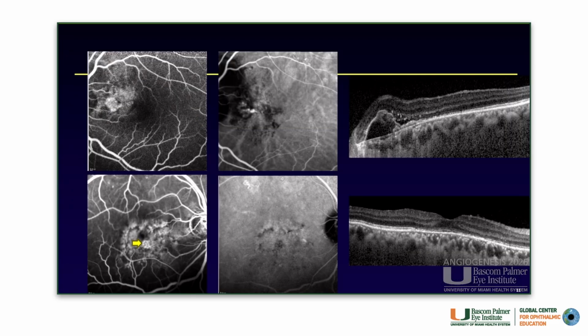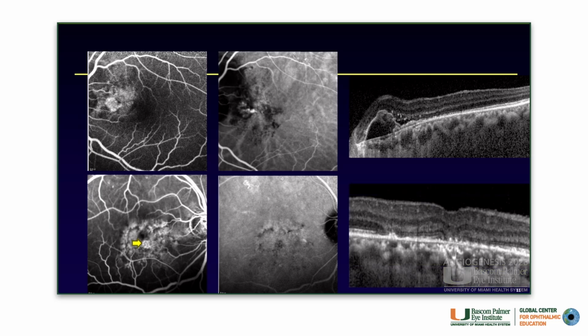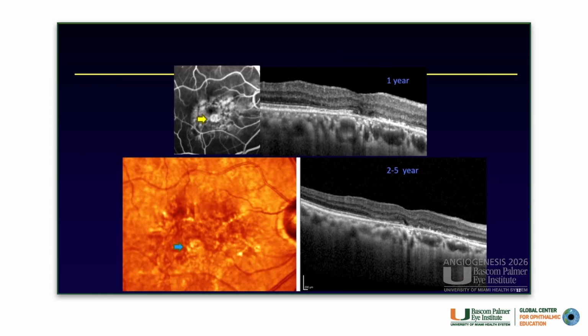Here is a different case with PCV peripapillary in the left eye, the first eye, and at baseline in the right eye, there was an area of perhaps iRORA. And over the follow-up period, you can see year 1, year 2, and now I'm going to show you the registered scans through year 2 to year 5. And you can see slow development of that patch of iRORA into clear C-RORA, as well as expansion in the en-face image. Note that the choroid is relatively thick in these eyes, so some may call them a pachychoroid background.